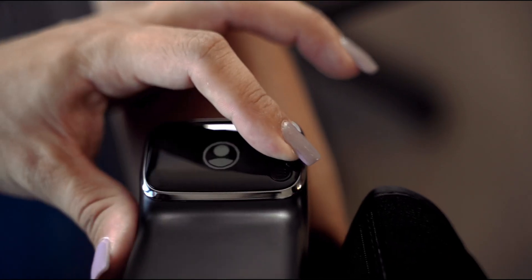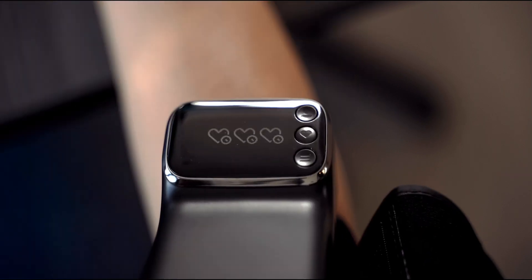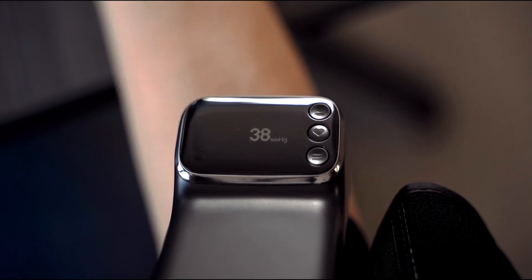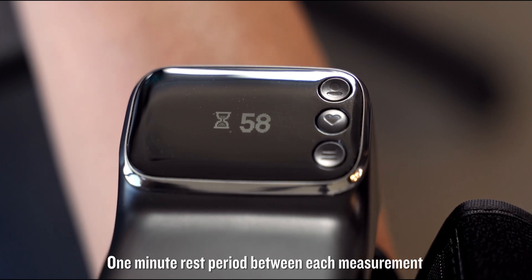If you'd prefer to be shown an average, select the option for three measurements by pressing and holding the heart icon until three hearts appear. The arm cuff will automatically inflate and deflate for each measurement with a one-minute rest period between each measurement. Be sure not to move or talk until the third measurement is complete.